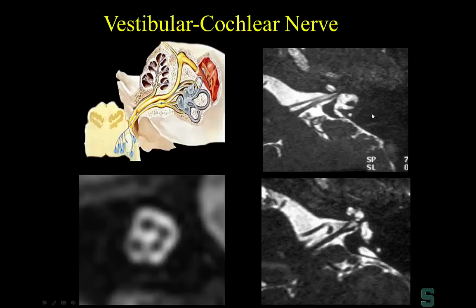On this coronal/sagittal view, posterior is back and anterior is front. Here's the facial nerve, and at the same level is the superior vestibular nerve. Beneath the seventh nerve — 'Coke down' — is the cochlear nerve heading through the cochlear canal into the modiolus. The inferior vestibular nerve is posterior and inferior, and this thickening of the ganglion is Scarpa's ganglion.